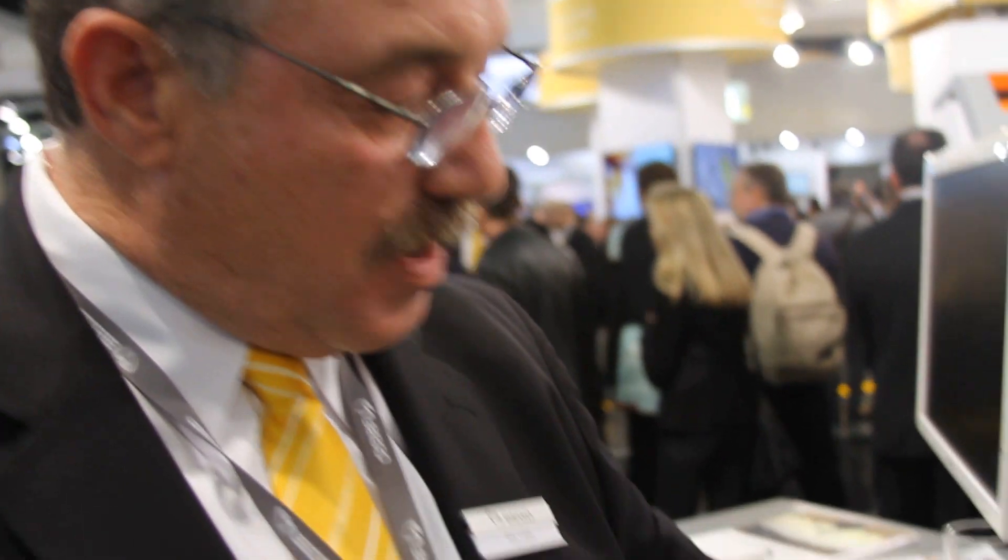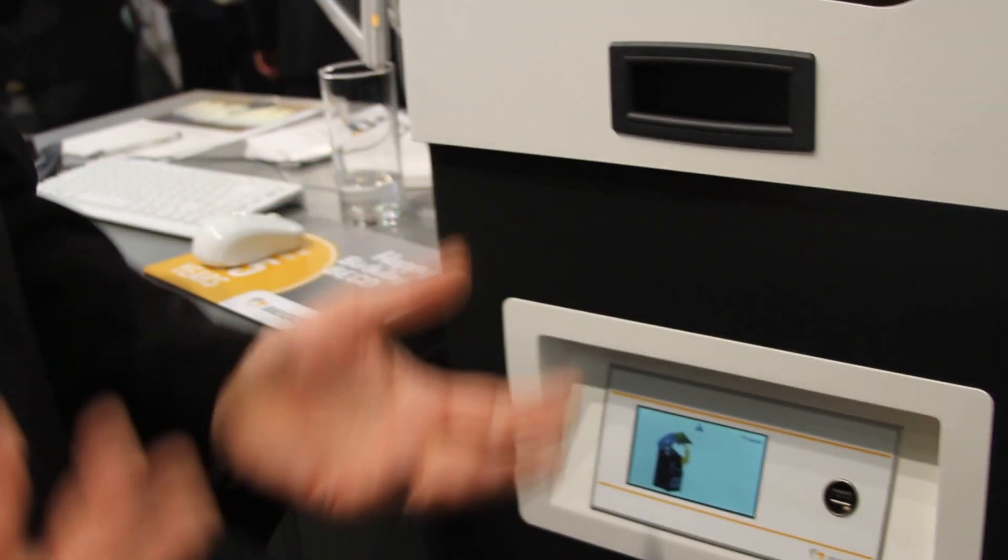Once everything is loaded into place, you just hit the start button. It reads the application and starts printing. The print resolution is from 50 microns up to 100 microns. It's 22 millimeters of print per hour, so you do your calculations on the height. You can do a vertical print as well as a horizontal print.